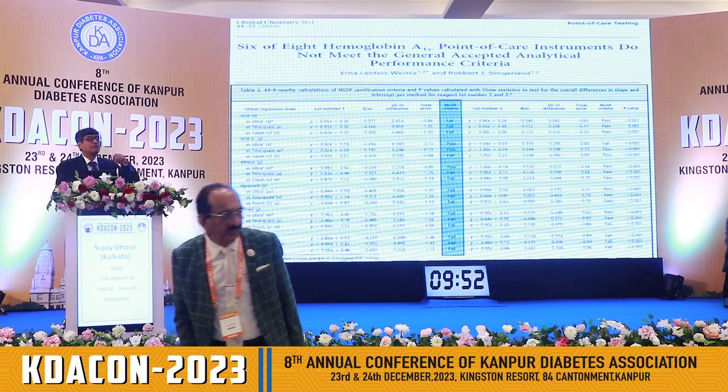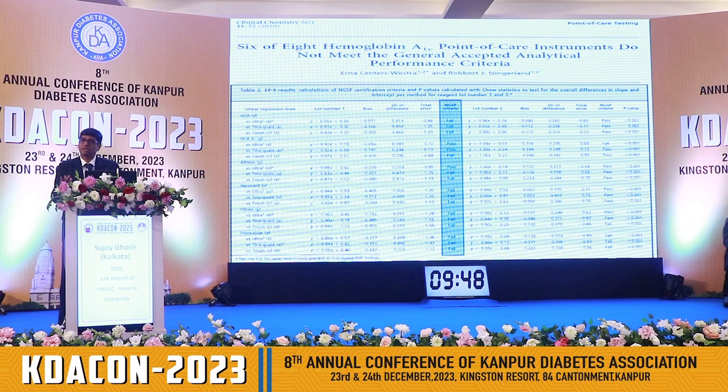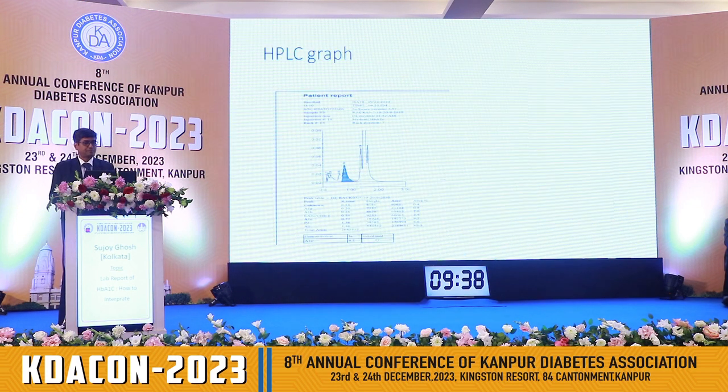Now, a lot of people will come to your lab and say, particularly for pharma, "Mera point of care machine hai sir, badhiya hai." You will see most of them are not validated. Most of them have interference with these variants that I am talking about.